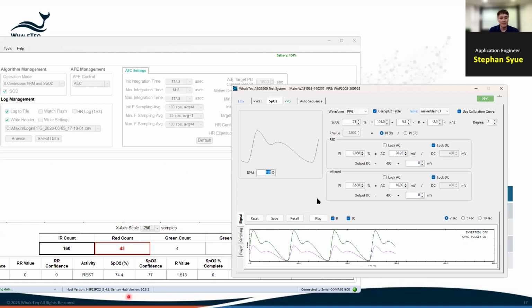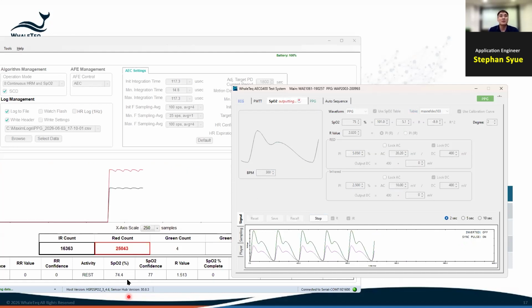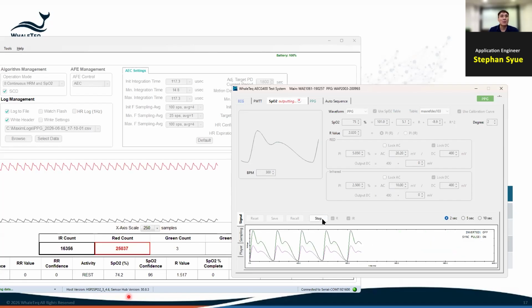And let's see what happens if we go to the maximum, 300. It's about 5 hertz, and the new signal cuts in, and then it's going to process this. And it's still within 1, oh, now even higher, but still within 1 or 2%. So it's pretty robust against the PR split.